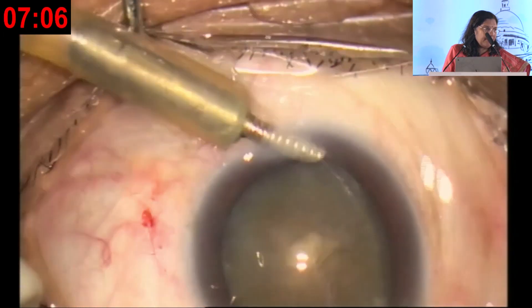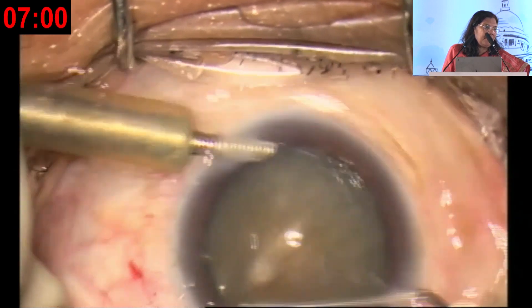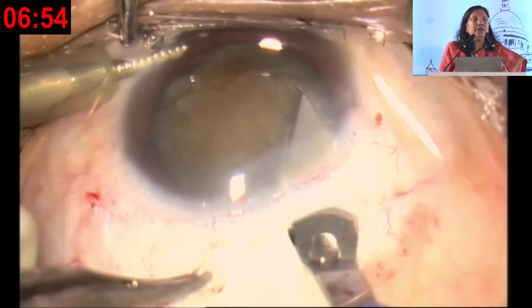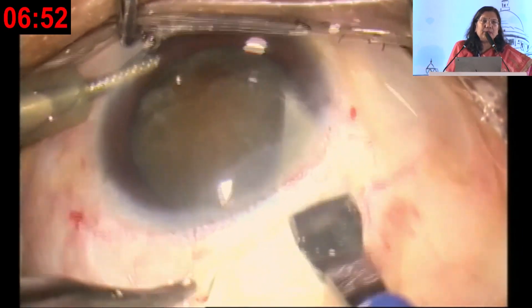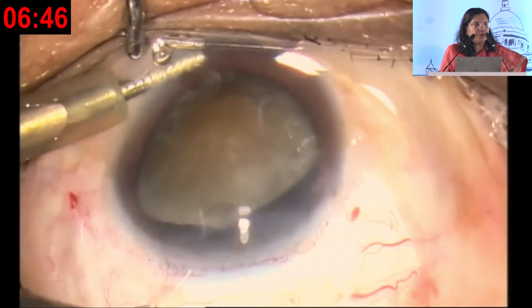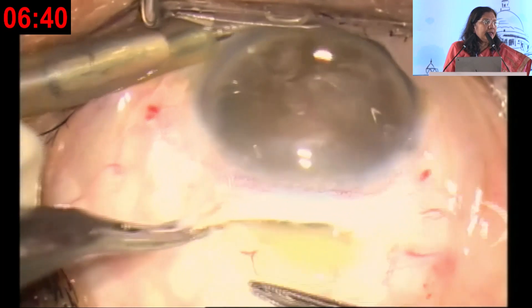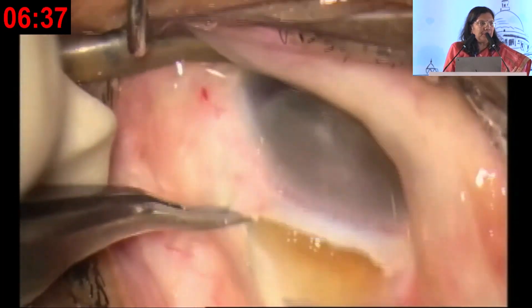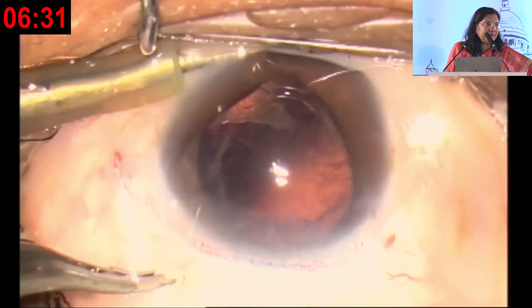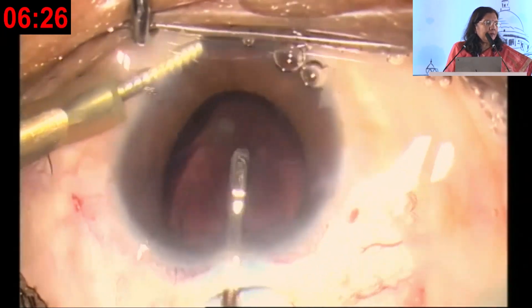Making the rhexis is important and you can also do it with a can opener. The nucleus is very large and very brown, but it can be removed through a reasonably sized incision — not more than six millimeters — because of the pockets, and it does not require suturing and does not cause too much astigmatism. This large brown nucleus occupies most of the anterior chamber, but it can be removed very safely without compromising the endothelium, and the IOL can be put inside the bag.